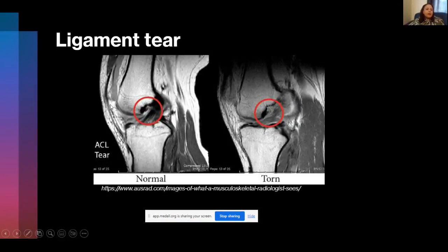That's an MRI of the knee. That's how a normal ACL looks. It looks like a black oblique ligament extending from the femur to the tibia. This patient has a history of trauma and the knee giving way after trauma. That's how the injured ACL looks. It's no longer that black, and it's lying rather flat over the tibial plateau. It's not stretched and oblique as it used to be. So that's a torn ACL in a trauma patient.